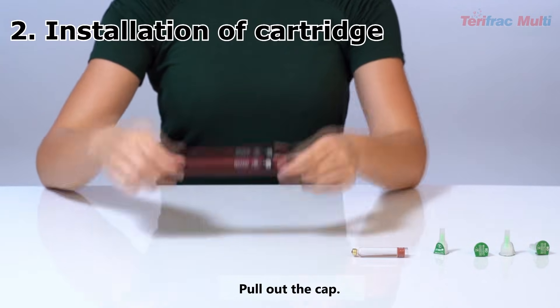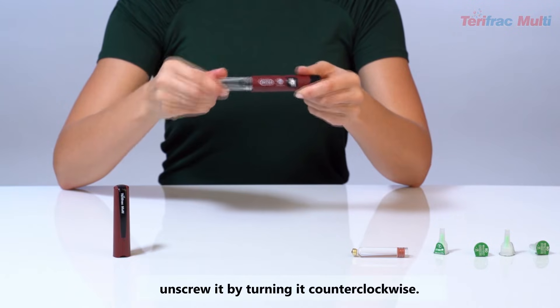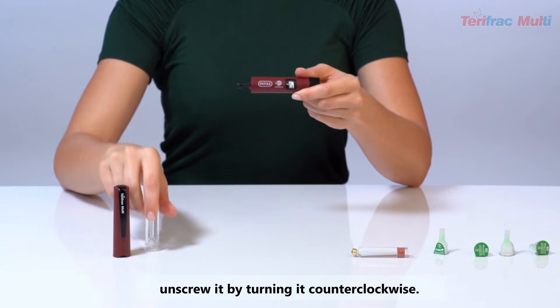Installation of Cartridge: Pull out the cap. You will then see the transparent cartridge holder. Unscrew it by turning it counterclockwise.